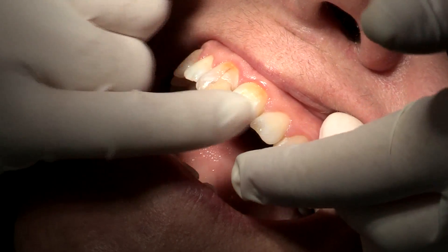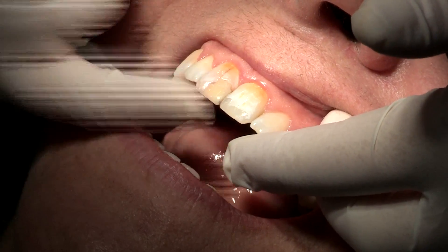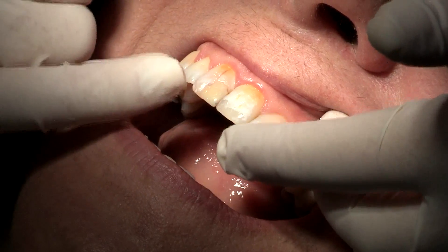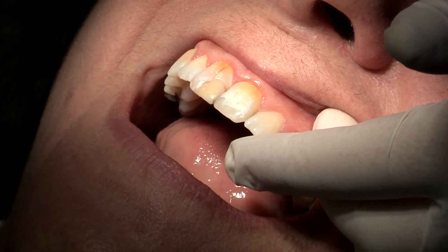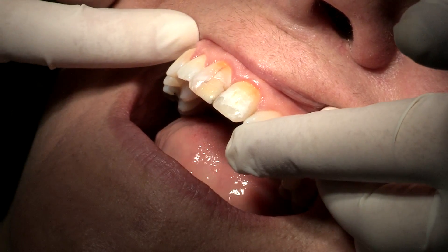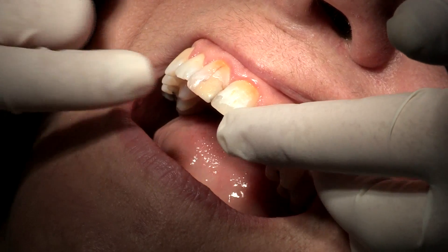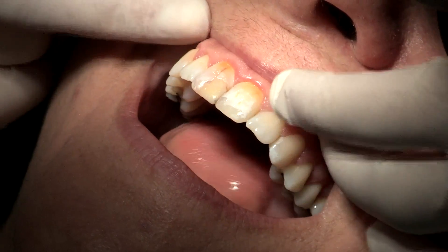Because I need to mask those colors, I will have to grind the teeth a bit and then use a composite that has a masking ability — something more opaque with translucency on top. With the UVeneer system, we usually use one layer of composite with some flowable composite on top, and I'll show you how it's done.